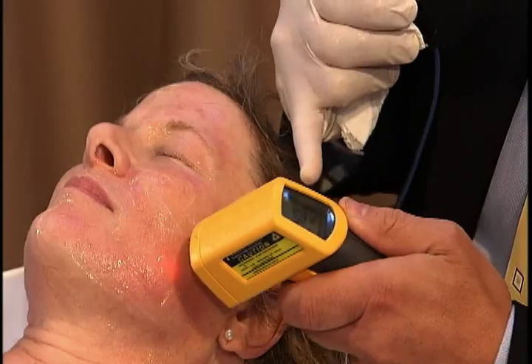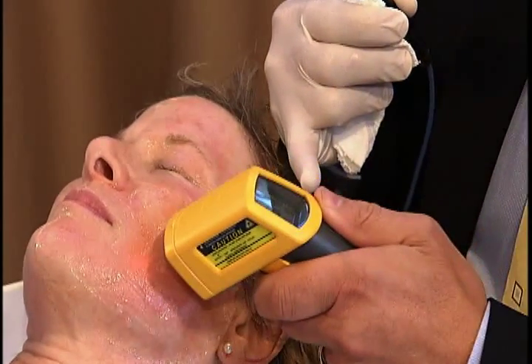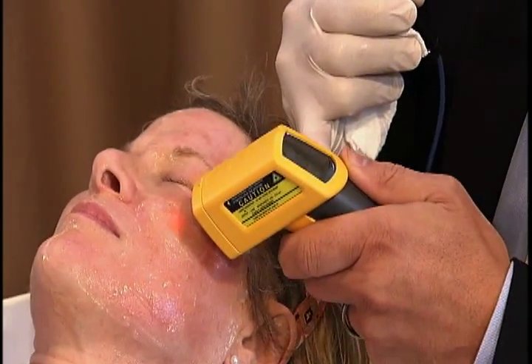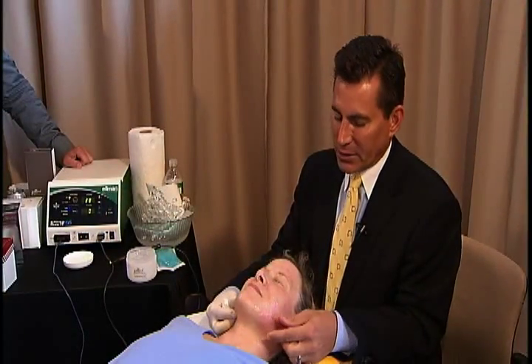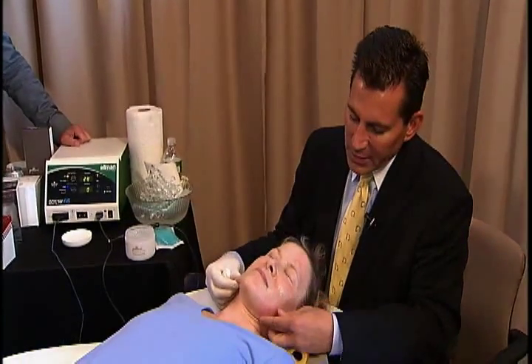42 down here in the lower cheek, only about 35 up there on the temple. 40, so that's pretty confluently heated. So this is just a single pass. Turn your face this way. And this is the pinch test.